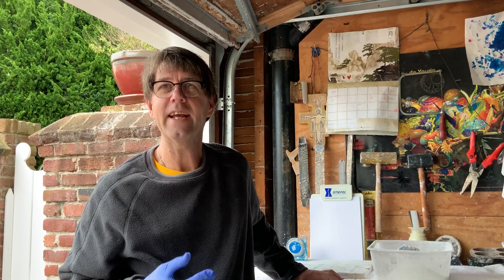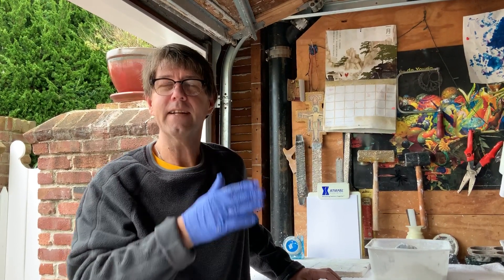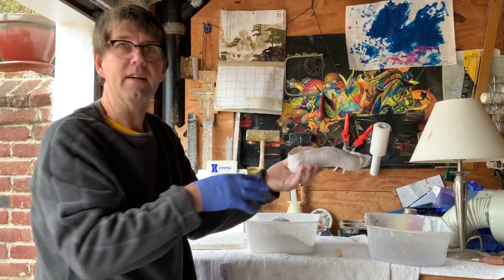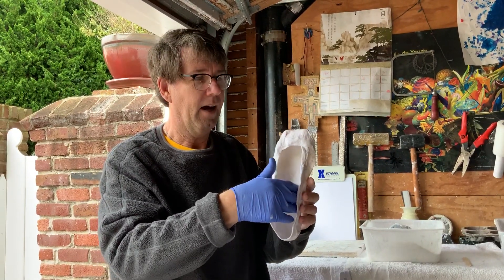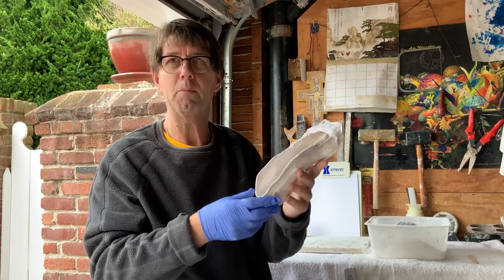Hello class. This is step three: orthotic making — taking our negative cast and pouring it with plaster to make a positive cast. We've already talked about bisecting the heel and pouring the negative cast in a soap like Simple Green to make sure that the plaster splints will come off easily.